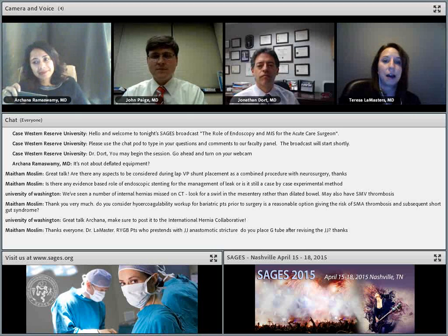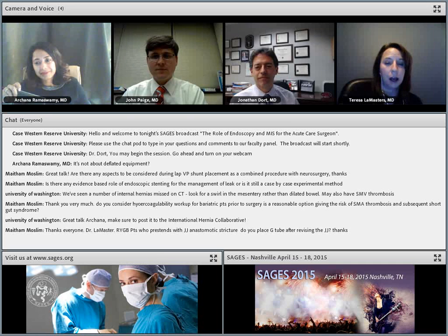But in bariatrics especially, things are moving towards not closing 10-12, especially if it's a dilating, non-bladed trocar. Having said that, if I have a trocar that gets stretched and I can obviously see that it's dilated, I tend to close those still because it's not really a 10-12 anymore. Now it's like a 12-15.